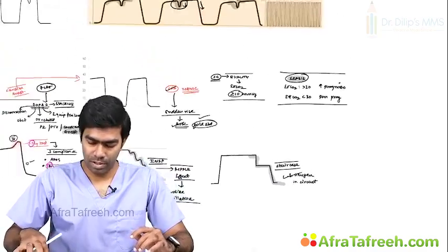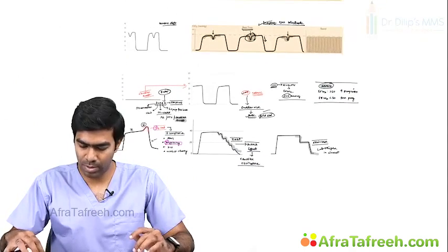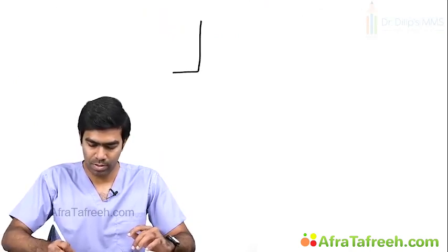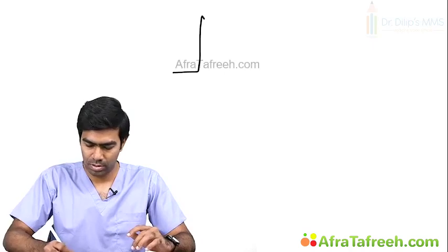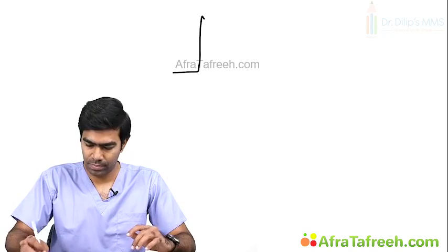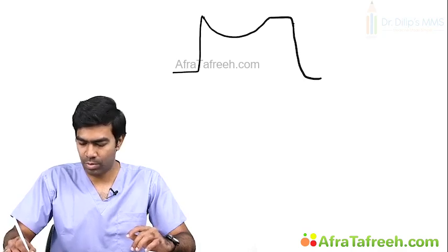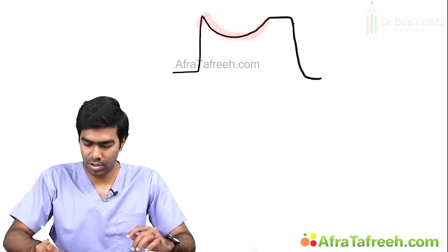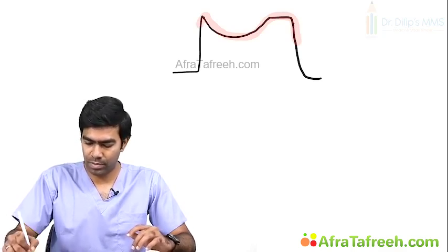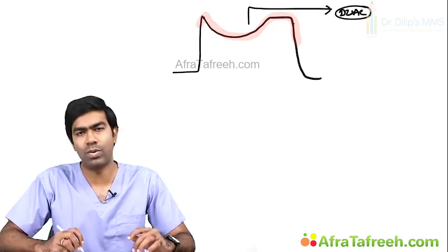Finally, you have certain other types of capnogram, called a dual capnogram. I didn't mention it, so I will tell you what a dual capnogram looks like. You might have something like this. This is not a curare cleft as well. This is called a dual capnogram, where you have a double waveform, especially during the alveolar plateau. So this is what we refer to as a dual capnogram.